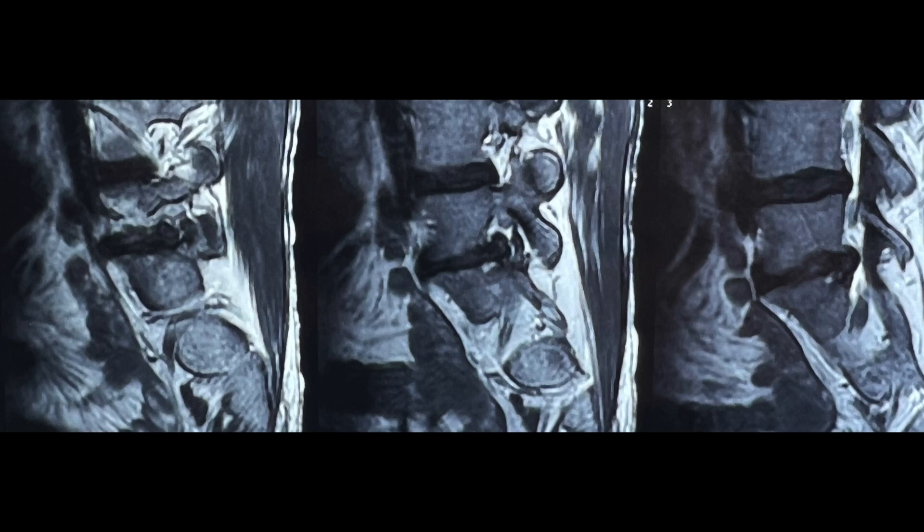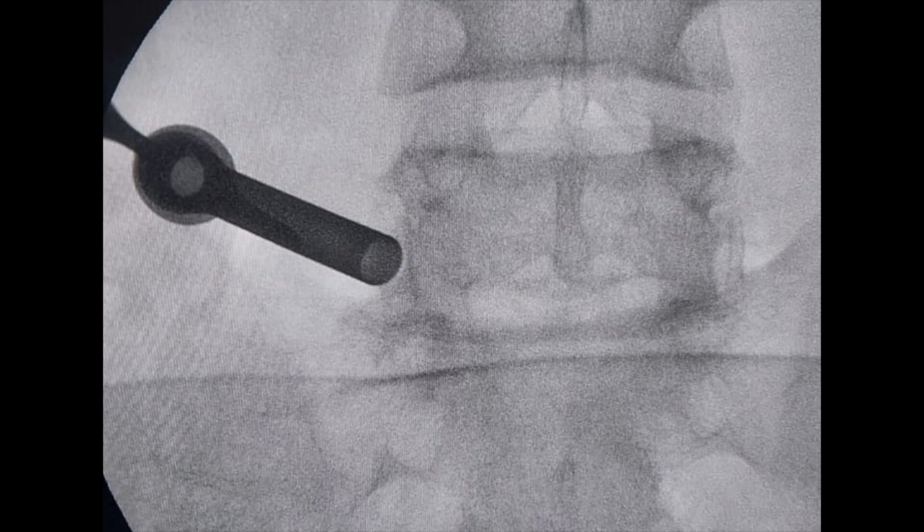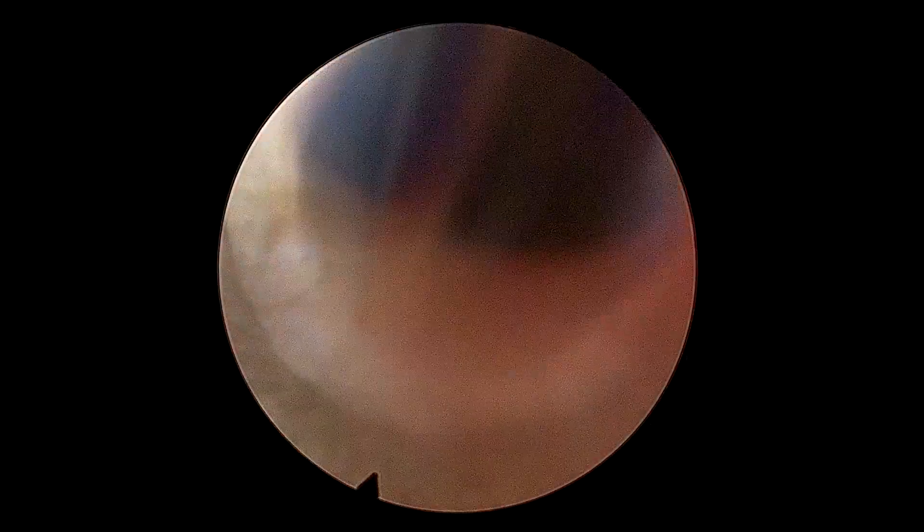This patient was taken up prone under GA with docking just lateral to the isthmus. Thereafter, once confirmed on AP and lateral, soft tissue dissection is being carried out.